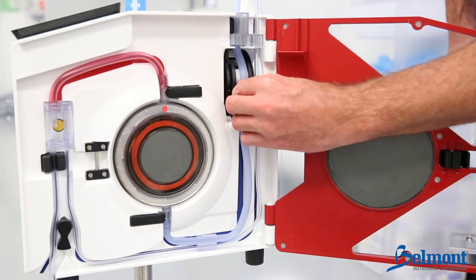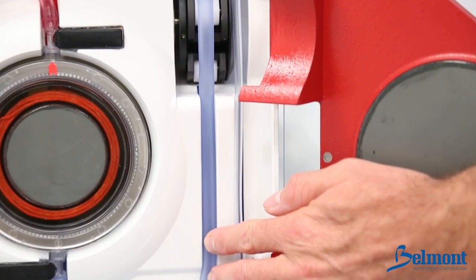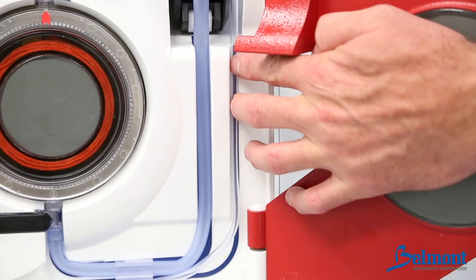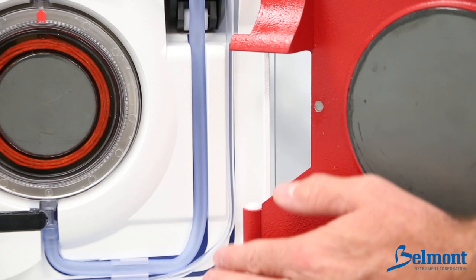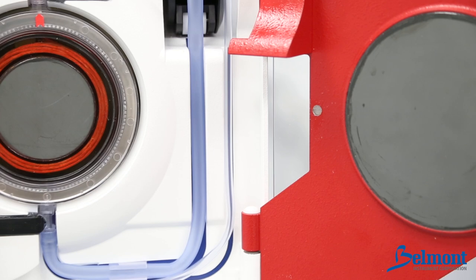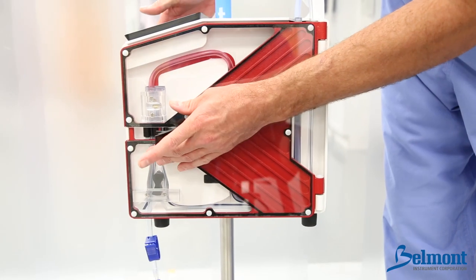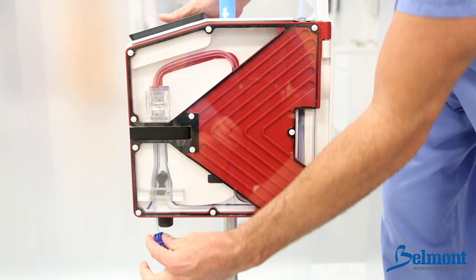Thread the wider tubing over the center of the roller heads. Make sure that the larger tubing is in the groove of the wider blue line and the smaller tubing is in the groove of the thinner blue line. Avoid stretching, kinking, and cross threading the tubing. Finally, close and latch the door, making certain the pump tubing is not caught.